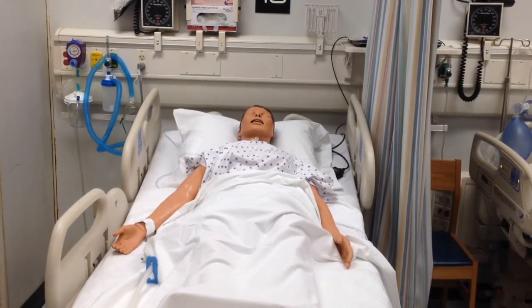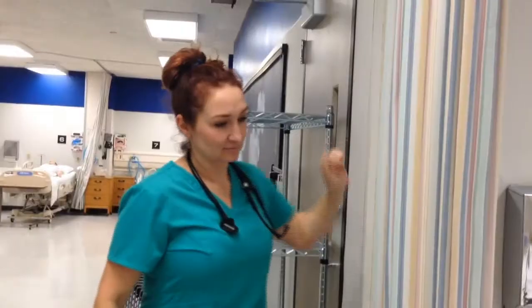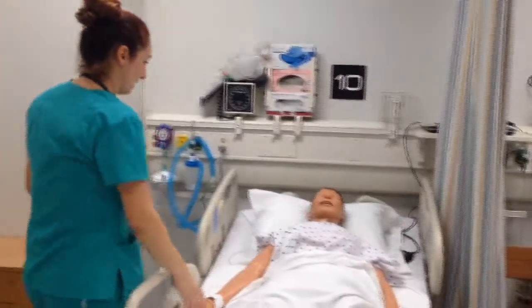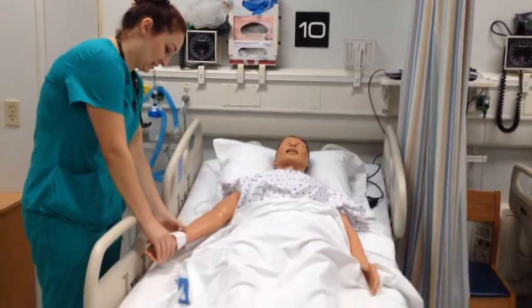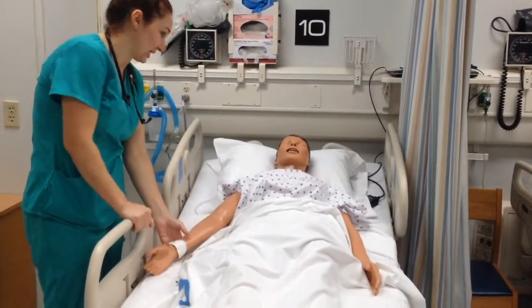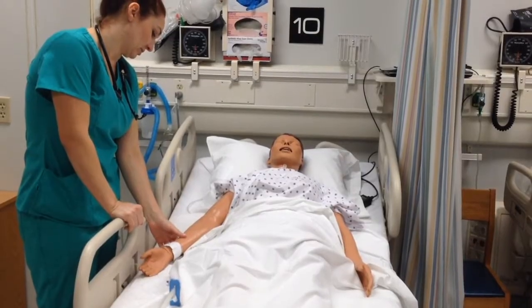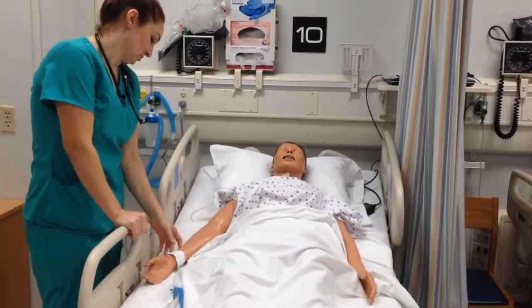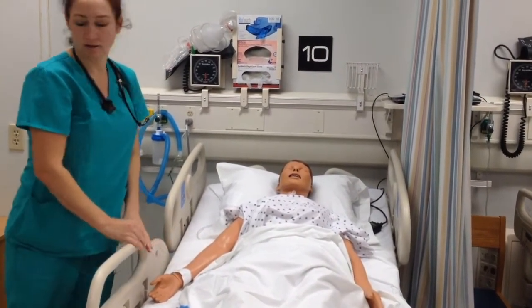This is a demonstration of the chest tube assessment. Hello Mrs. Smith, how are you doing today? I'm going to be your nurse for today. Can you tell me your full name? Jenny Smith. And what's your date of birth? 1-1-1940. Do you have any allergies? No.